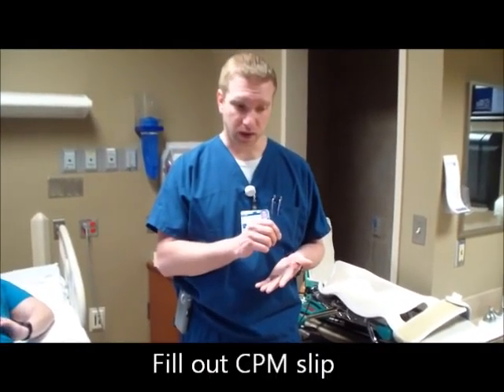So once you're done placing the CPM on the patient in our PACU unit, you're going to fill out your CPM slip. So you're going to place what leg you applied it to, the degrees of extension, the degrees of flexion, the assigned therapist to that floor. You'll also want to grab a patient sticker to place on that as well, so we can put that into the patient's chart to follow up with the patient once they get to the floor.